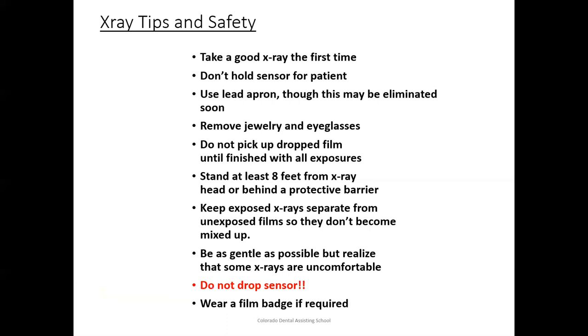Stand at least 8 feet away from the x-ray head or behind a protective barrier. Keep exposed x-rays separate from unexposed film so they don't become mixed up. We don't use film in our office. You don't have to worry about that because the x-ray sensor will continue to take new x-rays. However, if you are using film, you don't want to mix them up because if you retake it on one that's already been exposed, it will erase the previous one and give you a new one. So you don't want to do that.